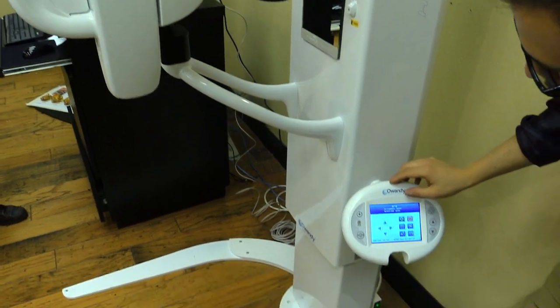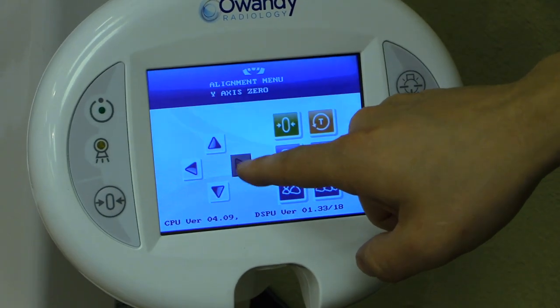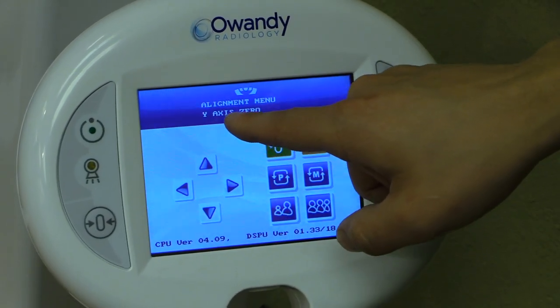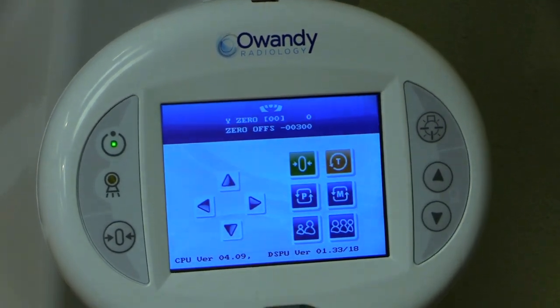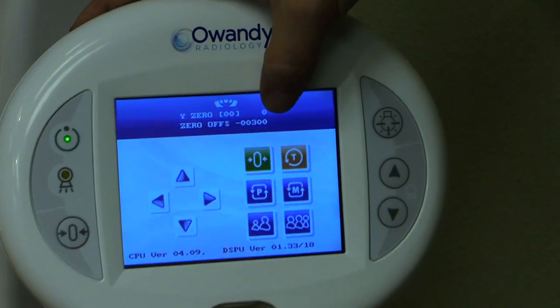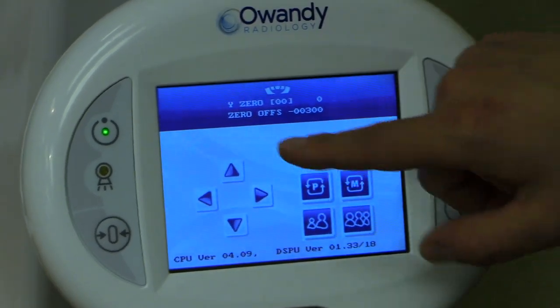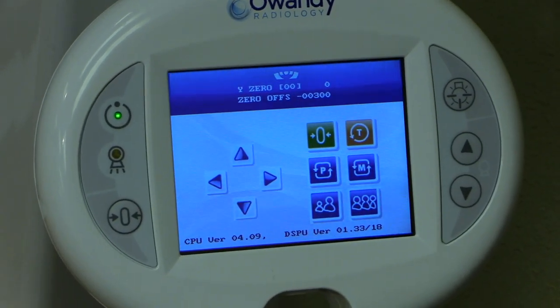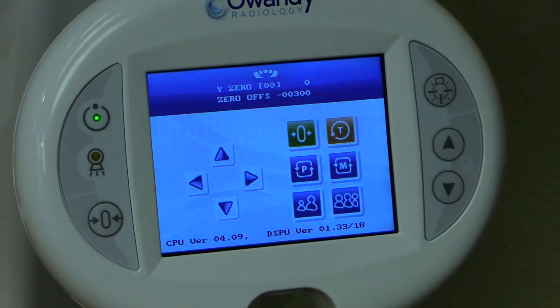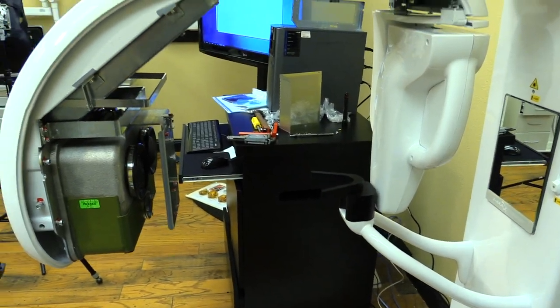When the system finishes moving, the first menu shown is 'rotation zero.' Skip to the right until you reach the 'Y axis zero' menu. Press zero to enter — it will flash the actual offset number of the Y axis. Press zero one more time and that will put the system into a twelve o'clock position, centering the tube head, phantom, and sensor.